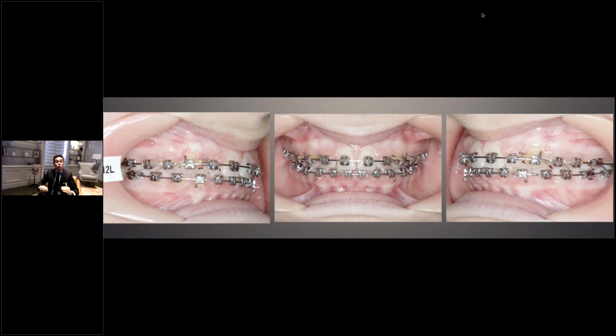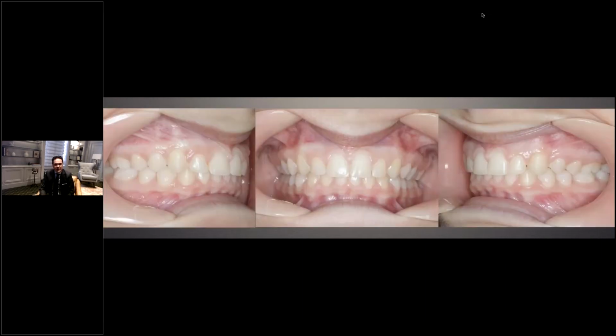And now we are able to initially level the anteriors, close the spaces in between the anteriors, and maintain those anteriors with a figure-eight metal ligature, and now retract them with torque and intrusion of those anteriors, with a beautiful exhibition of the nice retraction with the passive self-ligating bracket that is the Carriere SLX 3D bracket. Okay, this was the Carriere SLX bracket.